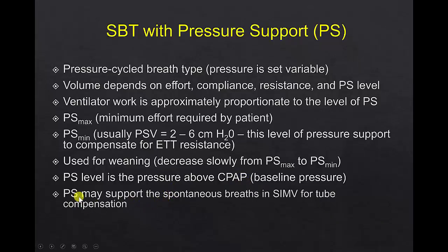We also can add pressure support to some modes that allow spontaneous breaths. For example, you'll see in a few minutes that IMV mixes machine breaths with spontaneous breaths, so we can add pressure support, and we frequently add pressure support to IMV to compensate for the patient's work of breathing through the tube during their spontaneous breaths.